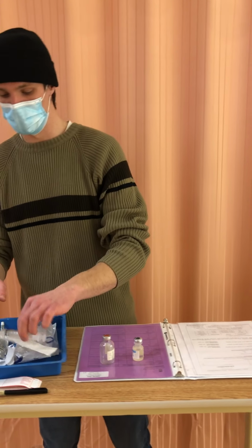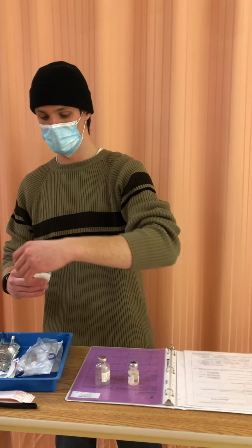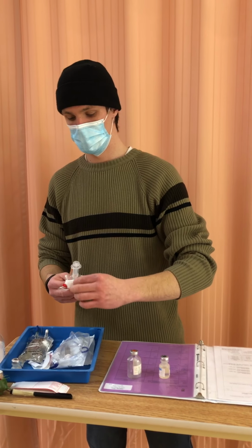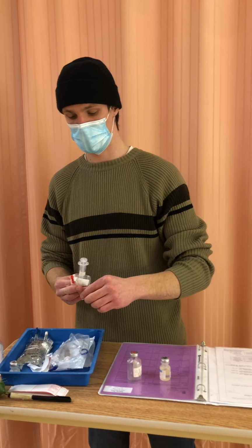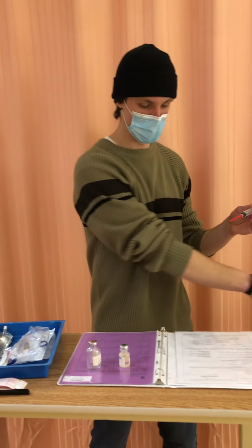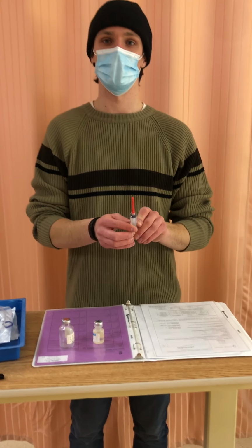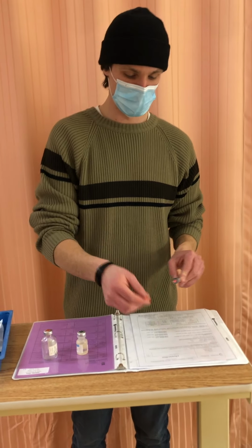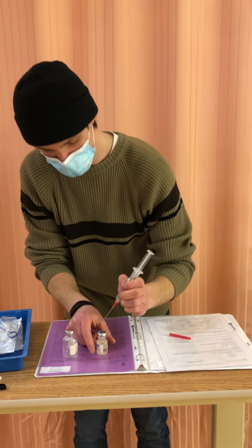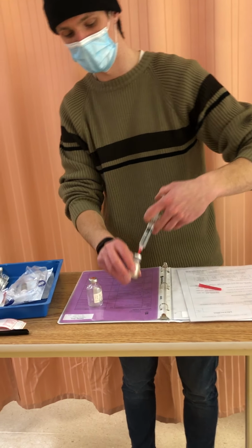So now I'm going to grab my syringe here and a blunt fill. Wing these back, and without contaminating the tip here, just apply. Won't be needing these anymore. So I'll be drawing up 6.8 milliliters of sterile water. So I'm going to draw out 6.8 milliliters of air and inject it into the vial here just to maintain that vacuum system in the vials.